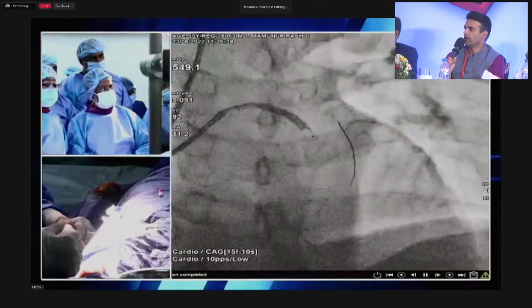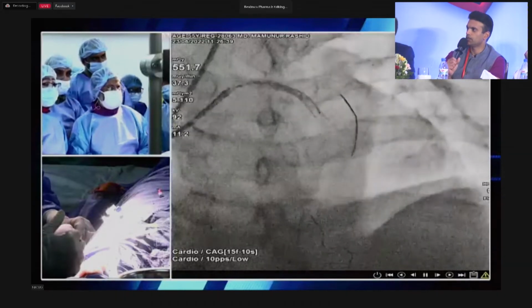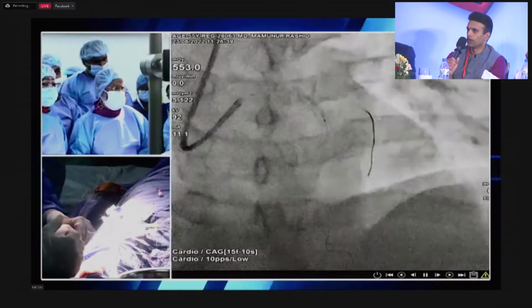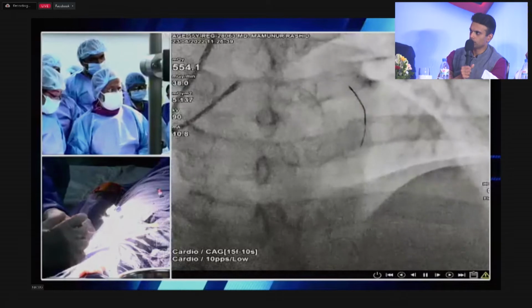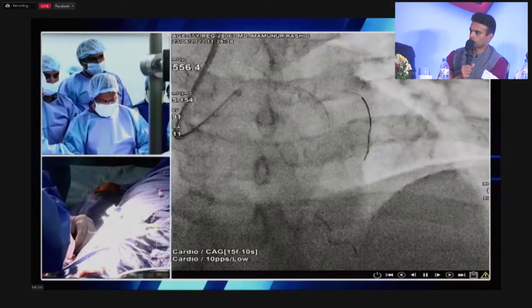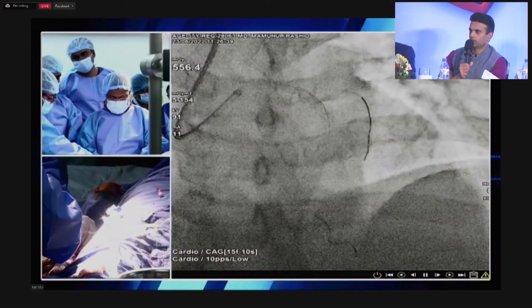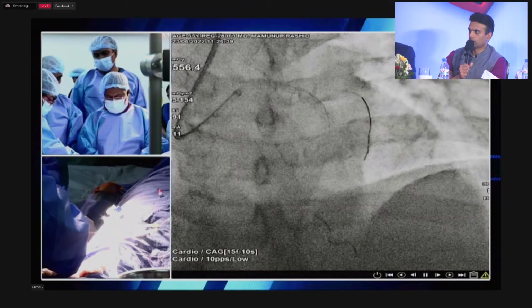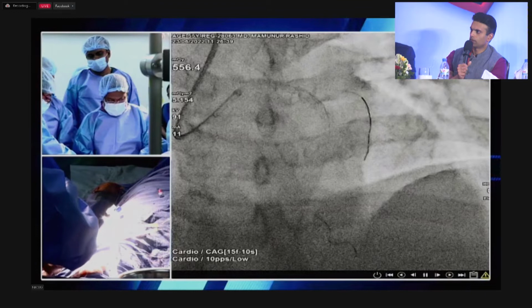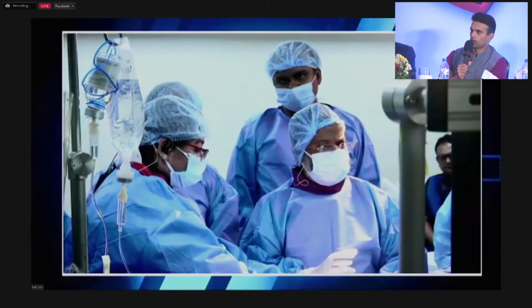So having high pressure post-dilated this with the stent deployment system balloon, are you going to take NC balloons to post-dilate? Yes, I shall do with high pressure balloon, but most of the time, I like to inflate the entire stent, avoiding the distal part of the stent by the stent balloon. That will give rise to the inflation of the entire stent very nicely.